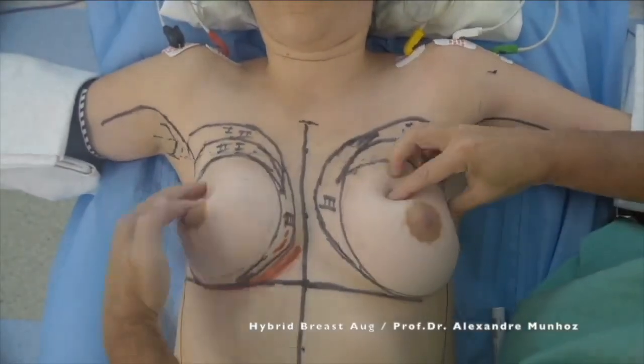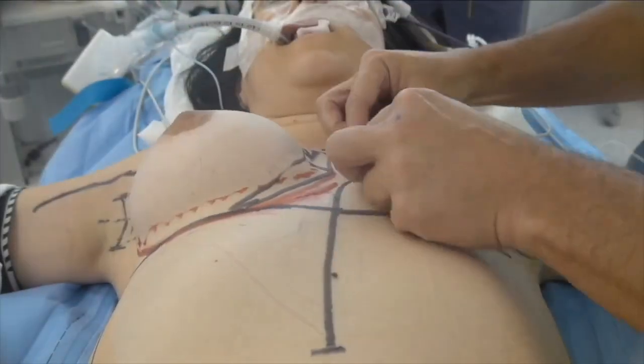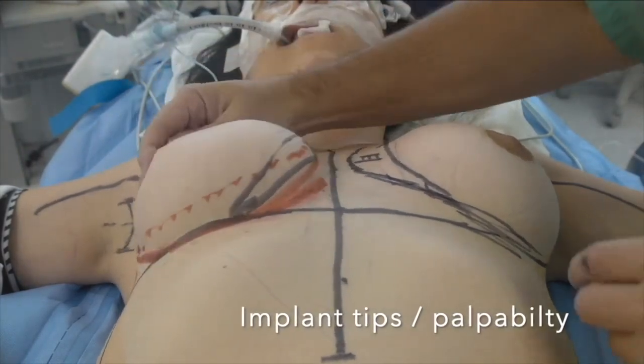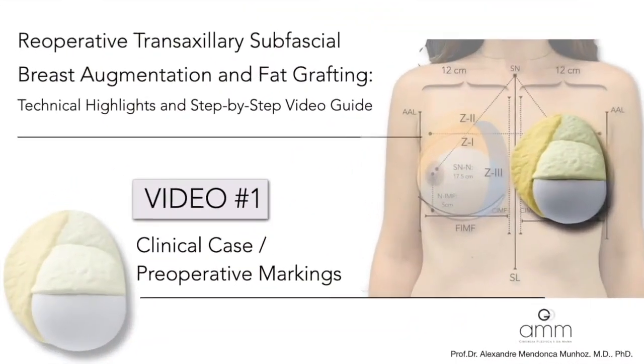Here you can note the instability of the implant and the difference between the right and left side and a large intermammary distance. On the right, you can see implant tips and a palpability of the implant.